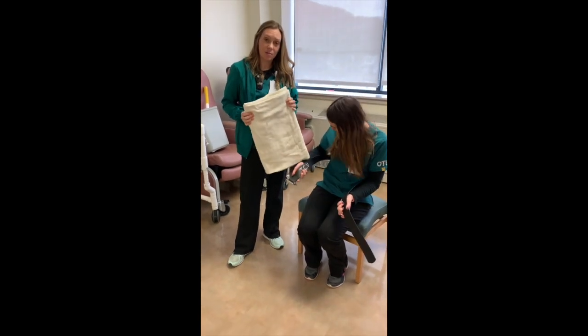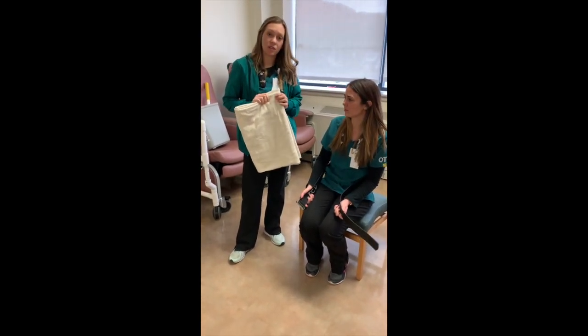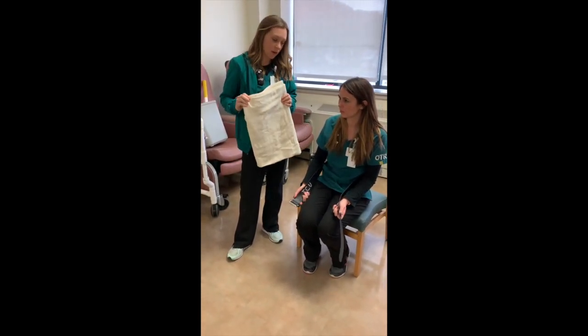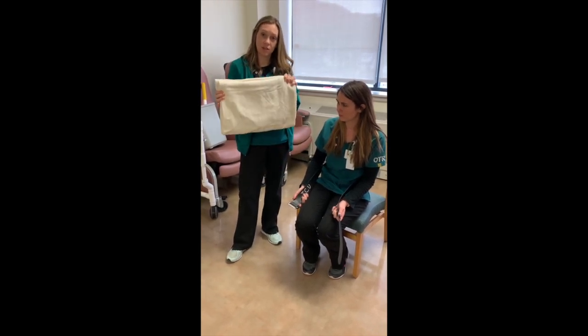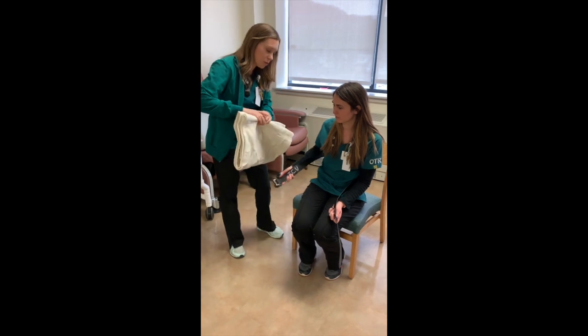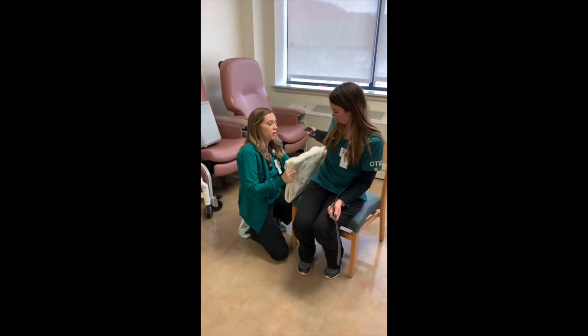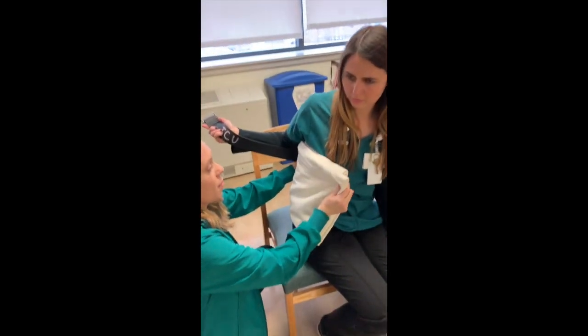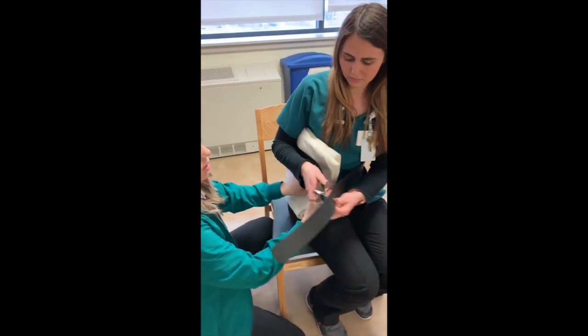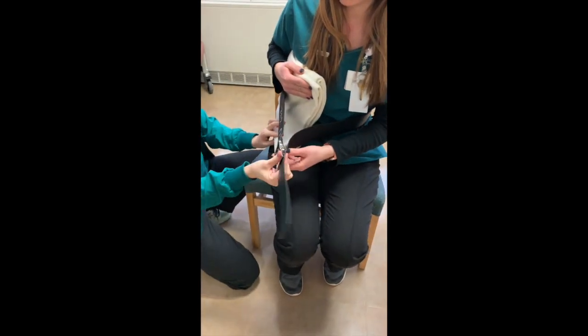One other tip with the gait belt: if you have a patient who's had a lung procedure like a VATS or thoracotomy, or if you have anyone with abdominal surgery, a blanket makes a good brace. So for the lung procedures, what we typically do is put it over the site of the chest tube, whether it's right under the arm or a little bit in the back, and bring the gait belt around and secure it just as you normally would.